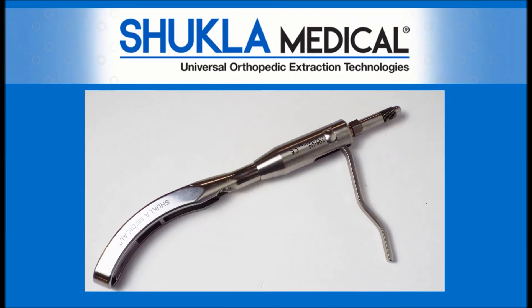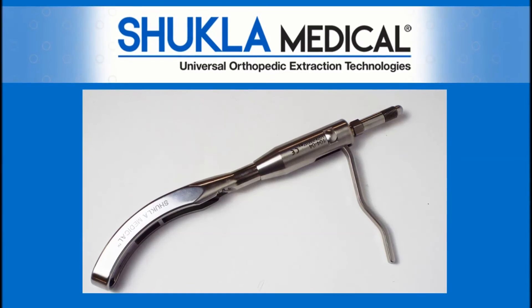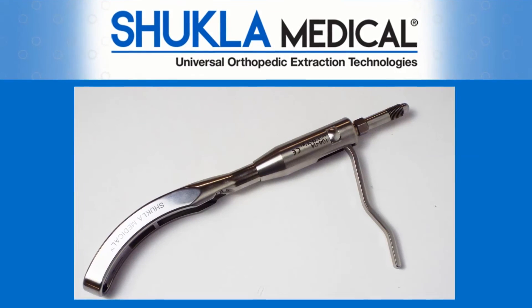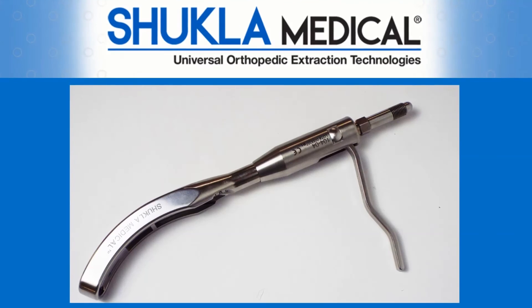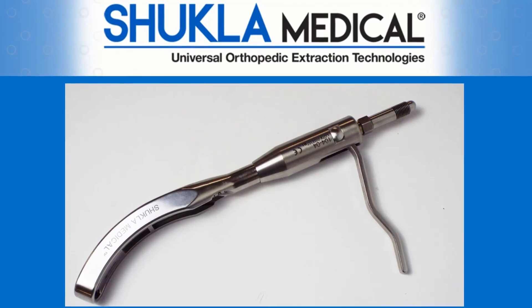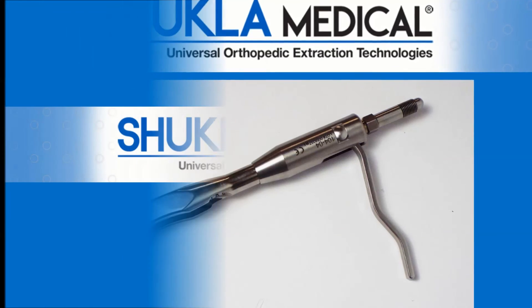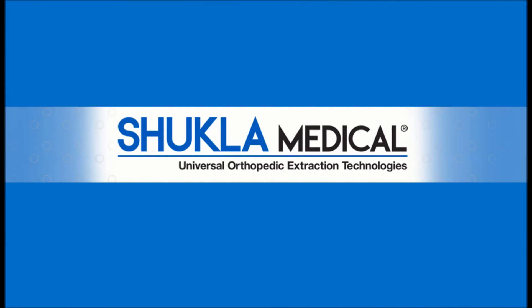Shukla Medical's current universal hip stem extractor is already the best one on the market. With this upgrade, we've made it even better. So continue to support your customer's current usage. When the time comes to replace the pushrod, let them know they'll be getting the upgraded pushrod and the reconfigured cam handle. We are Shukla Medical, the hardware removal experts. Because every minute counts.